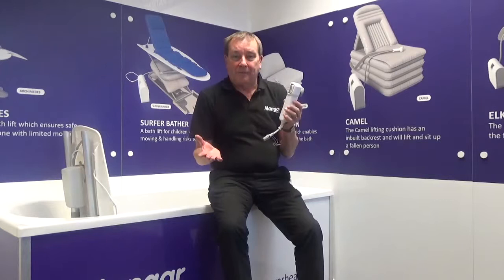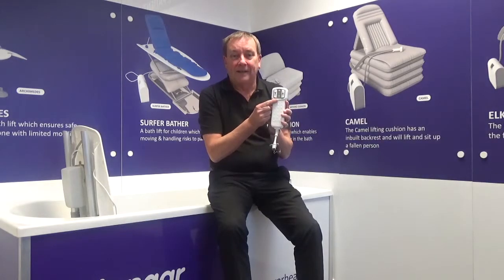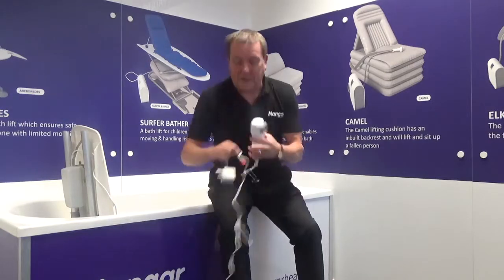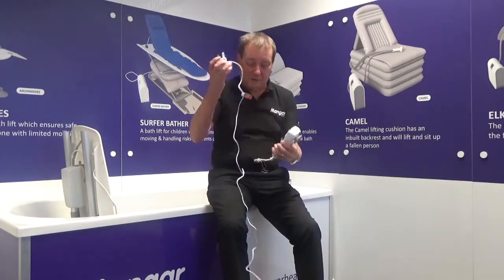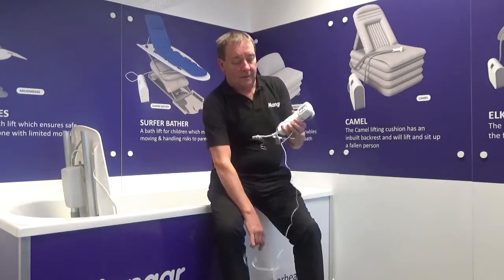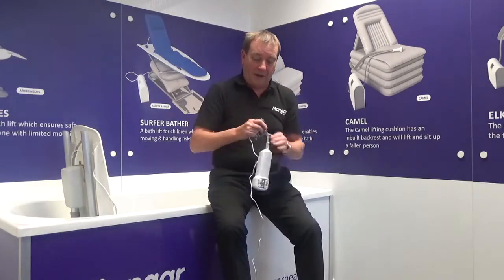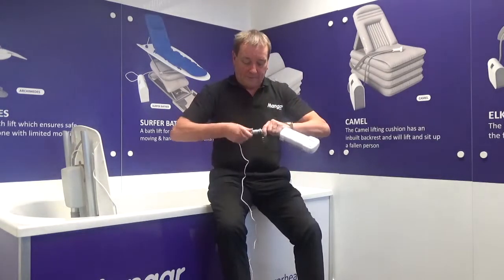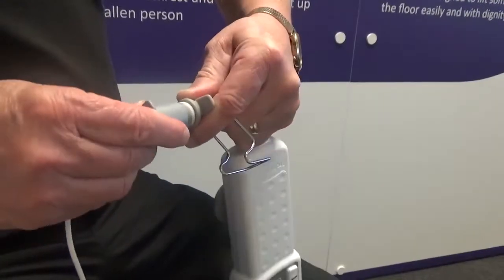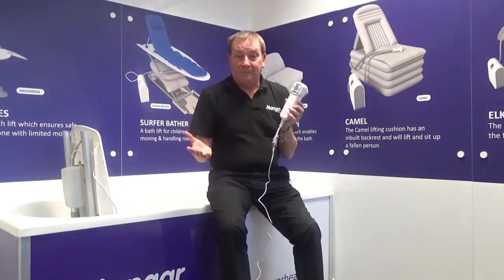You can recharge the bath lift whenever you feel like it. However, once I see the flashing light, as we have here, it's essential it goes on charge. The charger supplied is quite simple. Just a plug-in unit and another connector. This connects in exactly the same way as it did when we connected it to the bath lift itself, and it will only go in one way. I can now plug it in the mains and leave it.